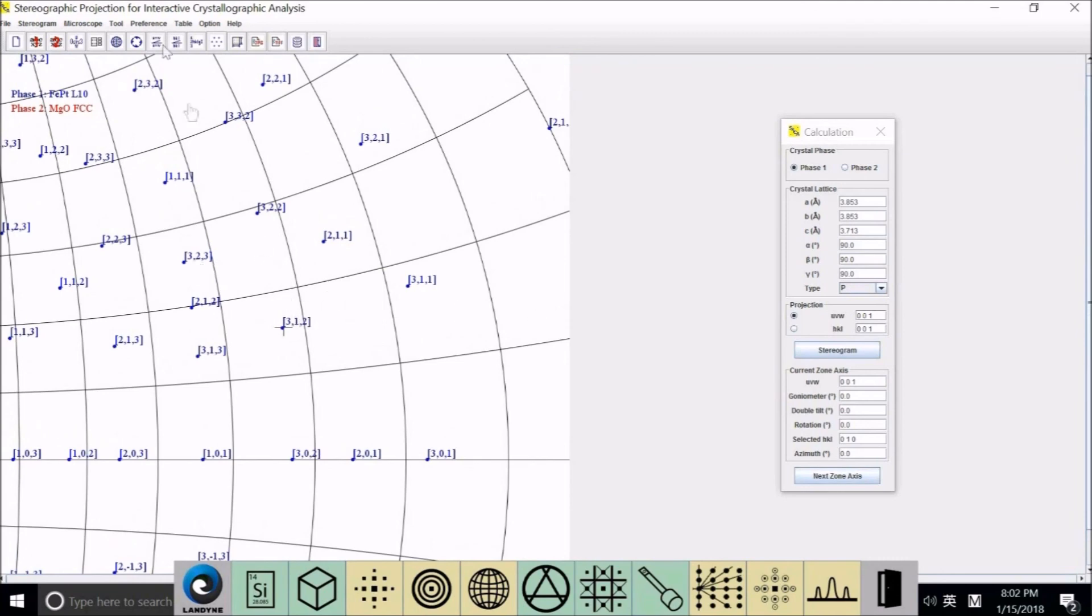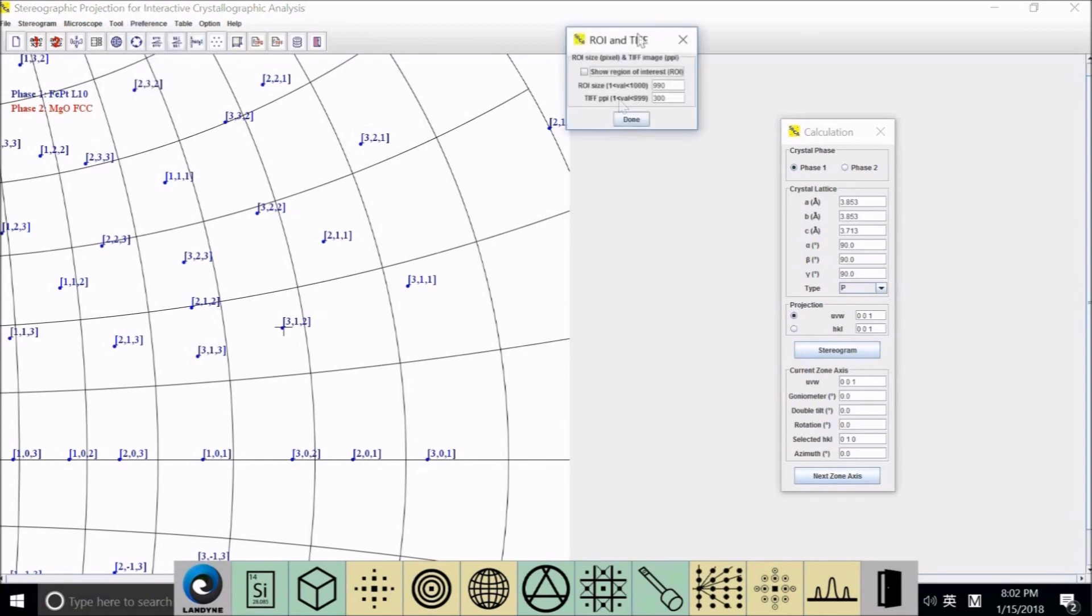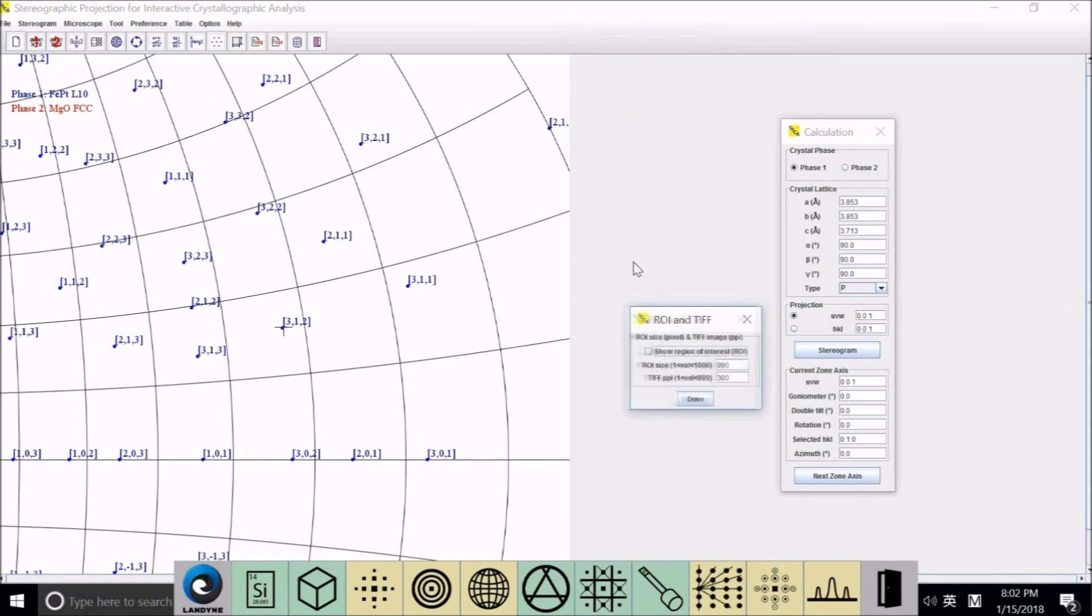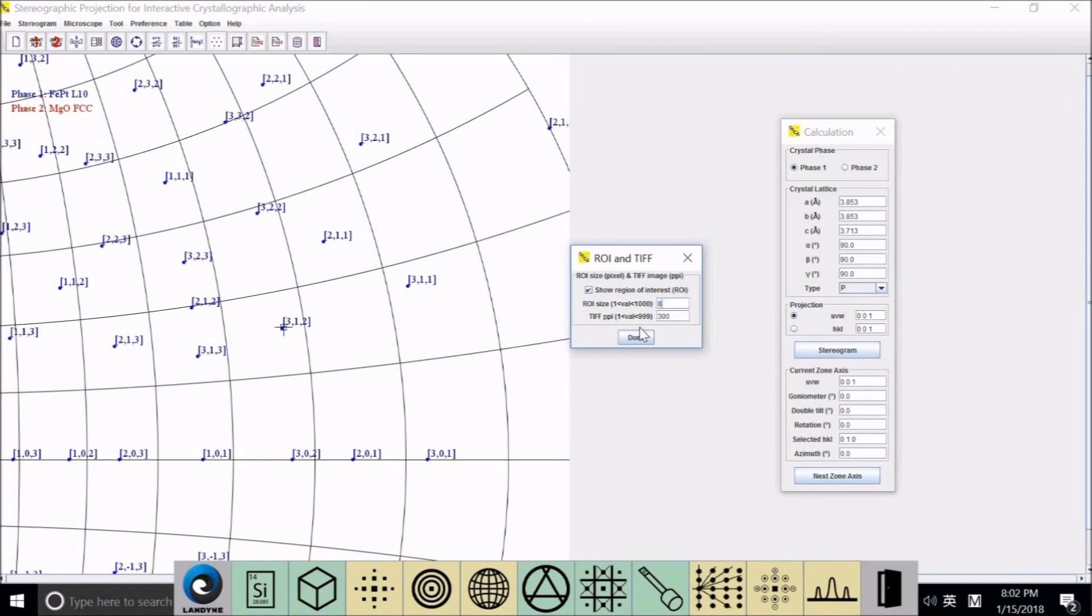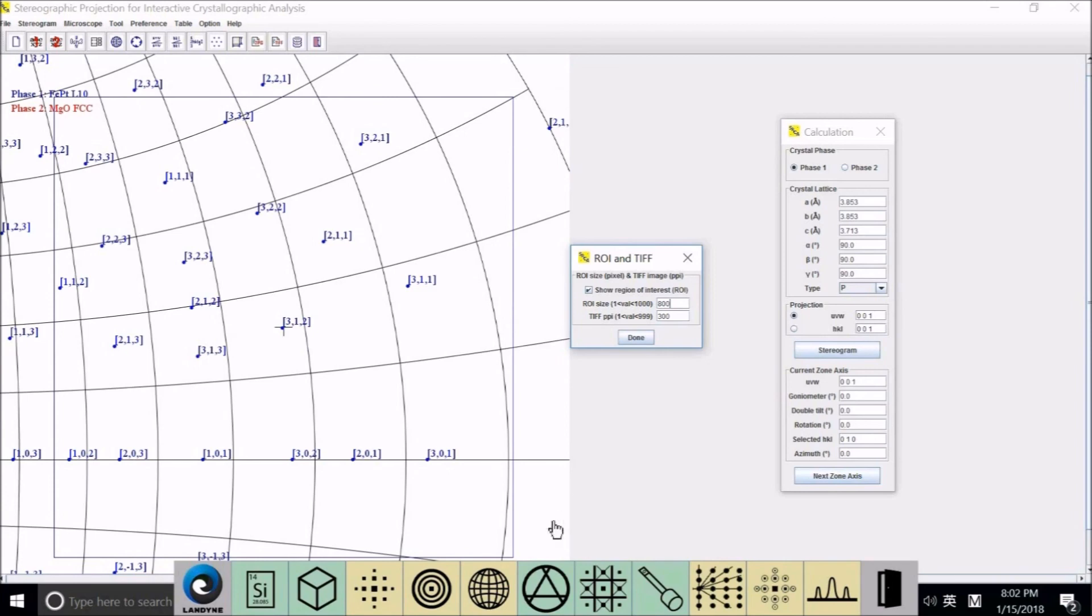Now I show you the region of interest. In the preference, click here. We can select this area and define the size, like 800 by 800. And you can see a blue square here showing the region.